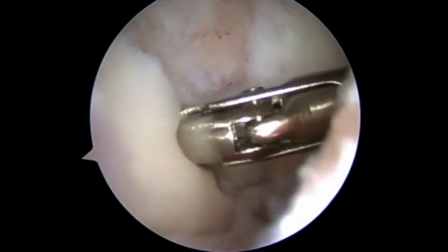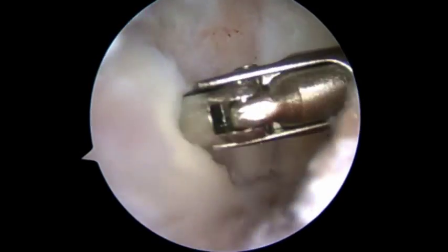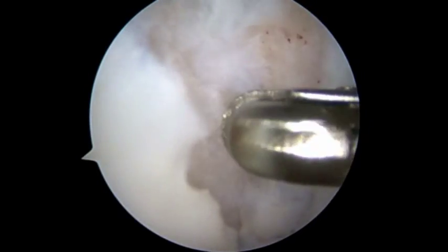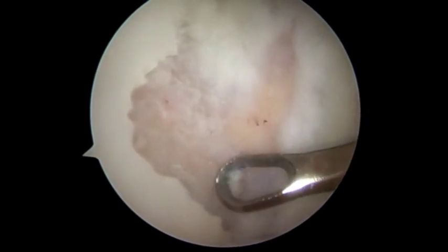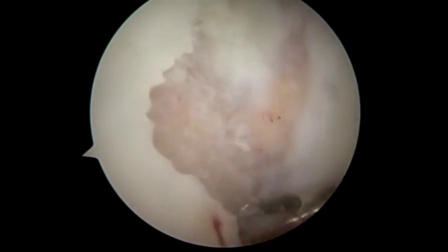The second case is a trochlear defect without any maltracking. You can see, to help get a nice stable edge of cartilage, here we used a suction punch. After this, we used an arthroscopic curette, which removed the excess cartilage on the lesion. It is helpful to have different angles of curettes available to you.